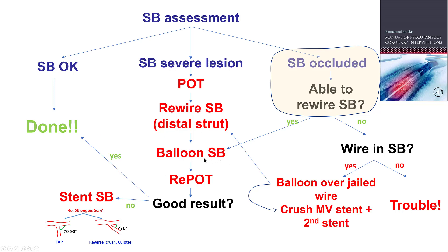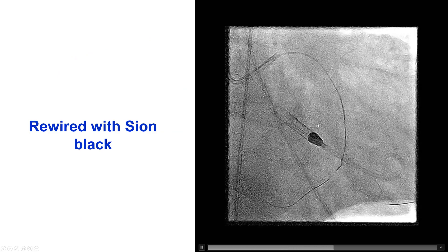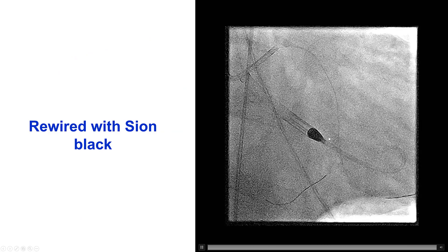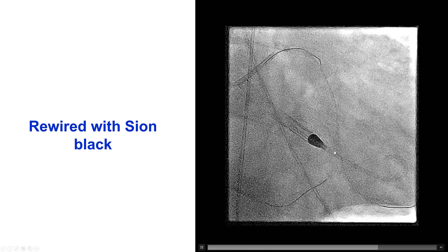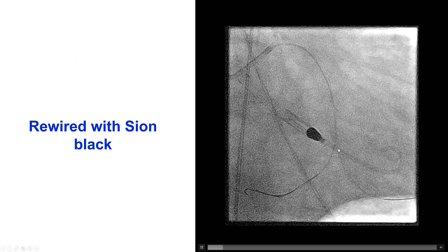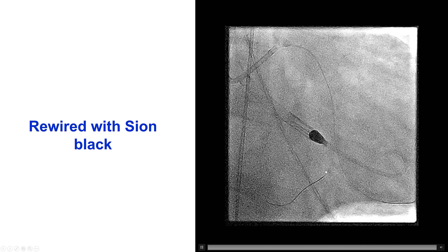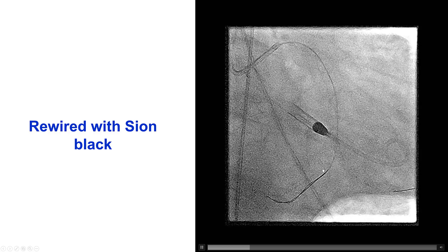But if balloon inflation is insufficient for getting a good result, then the side branch may need to be stented, either using the TAP technique, reverse crush, or culotte technique. In this particular case, we were actually able to rewire with another Sion Black guidewire using the original wire as a marker of the location of the distal circumflex.